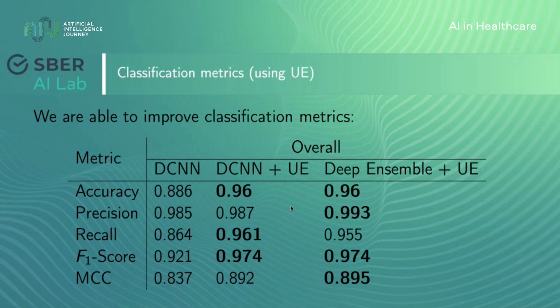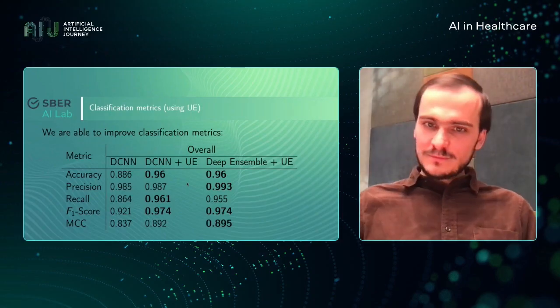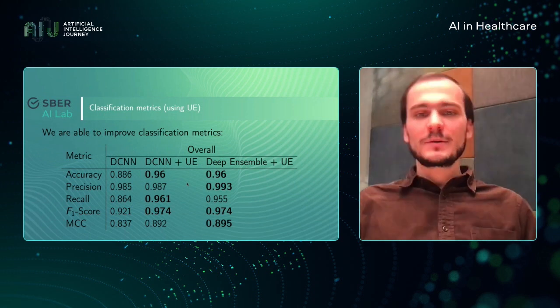We also compare the approach I described, assessment of uncertainty through dropout methodology, Monte Carlo dropout, against another approach to assessment of uncertainty, where an ensemble of models is learned through adversarial attacks, and the results are quite comparable.